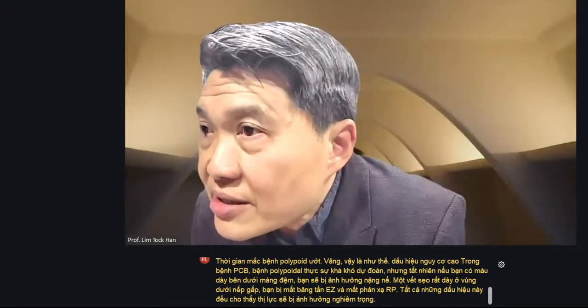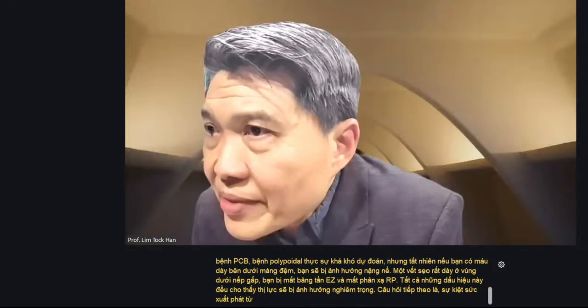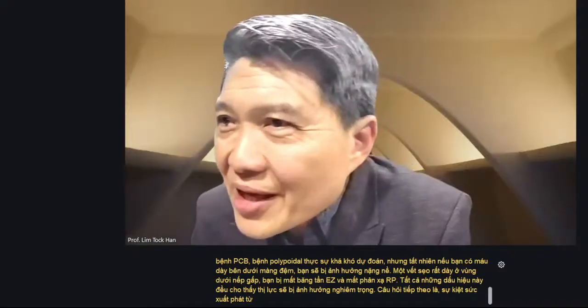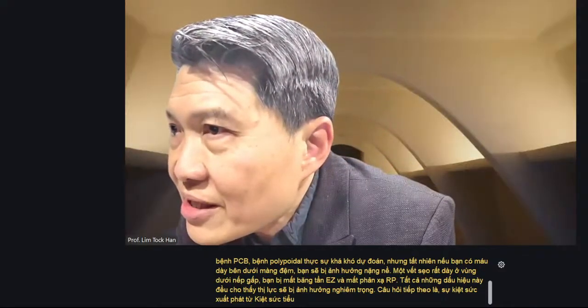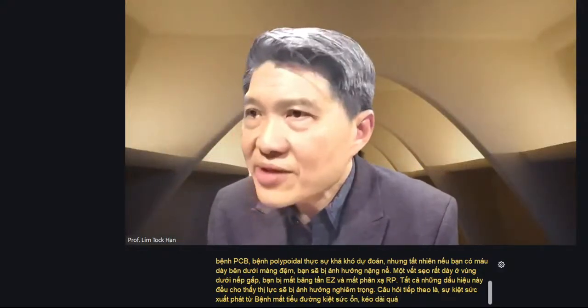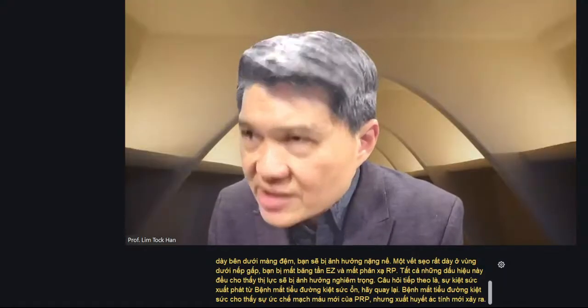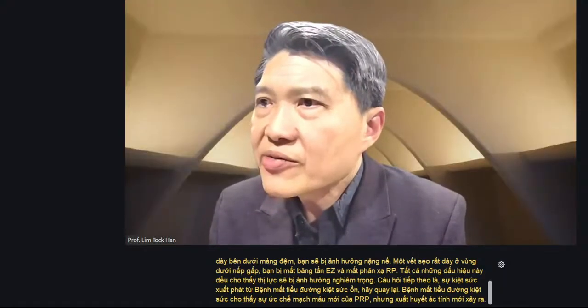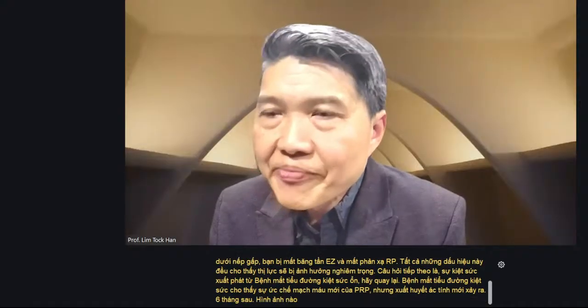Next question is from Muhammad Mokhtar. Burnt-out diabetic eye disease shows neovascularization regression after PRP, but new vitreous hemorrhage occurs 6 months later. What imaging would you prioritize before retreating?